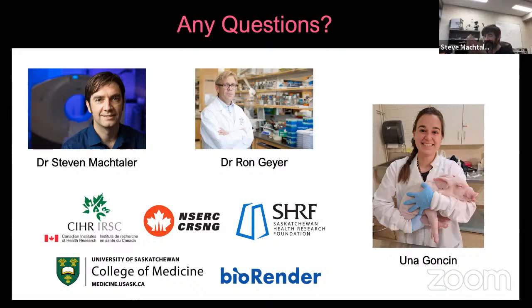That's a good question, and a physics colleague of mine asked that before too. I can't remember the actual pressure in the bubble, sorry. But they do remain stable at that low shell. The lipid shell actually reduces the surface tension and helps stabilize the microbubble itself. I would have to get the actual numbers for you. That was a good question.